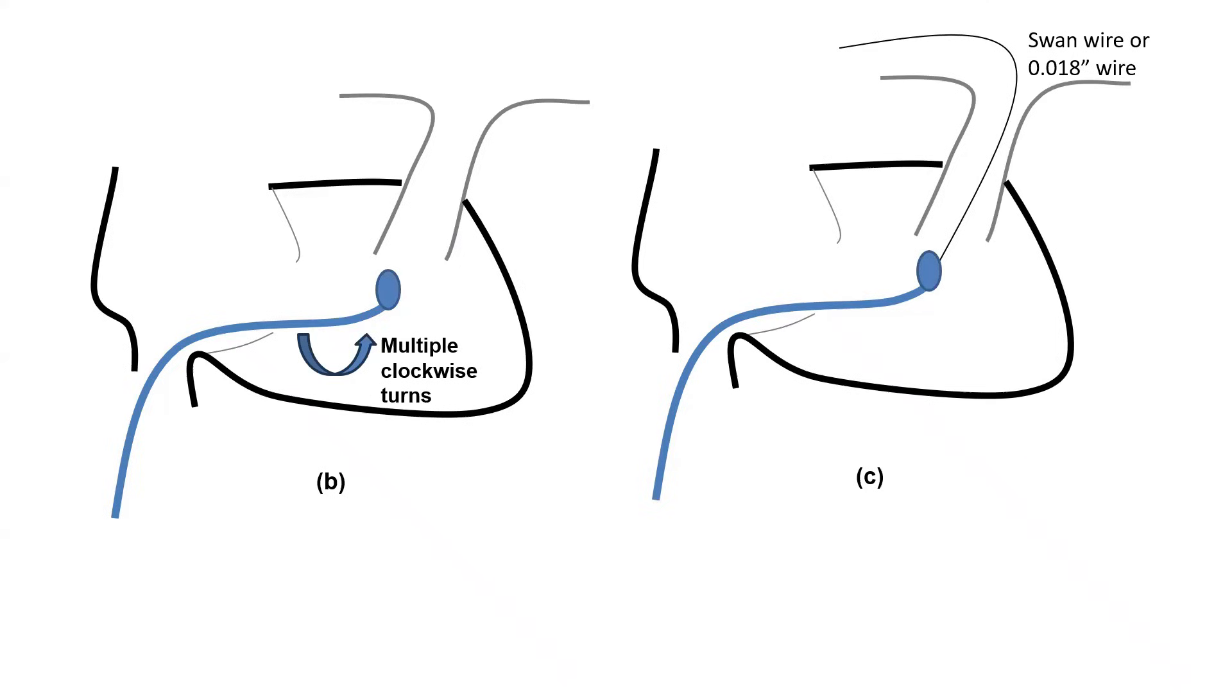Again, the catheter is difficult to torque, so we have to do multiple torques with a lot of push and pull, brief push and pulls to transmit that torque.